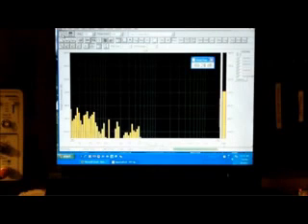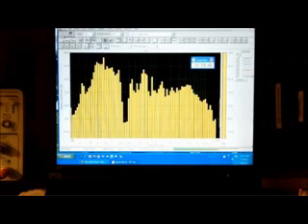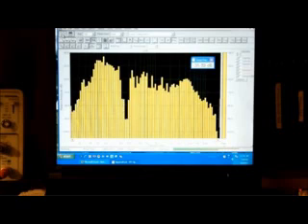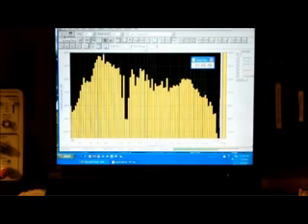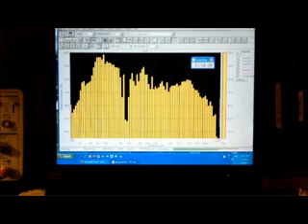There you can see we're looking at the spectrum analysis, and I start the excitation signal. You can see that there's a hole in the spectrum somewhere in the 200 Hertz range, and now I can bring up the probe tone, which you can see there. So the idea here is to make sure that the excitation signal does not leak into that hole in the spectrum in any significant way, so that the probe signal can accurately measure any change in volume.